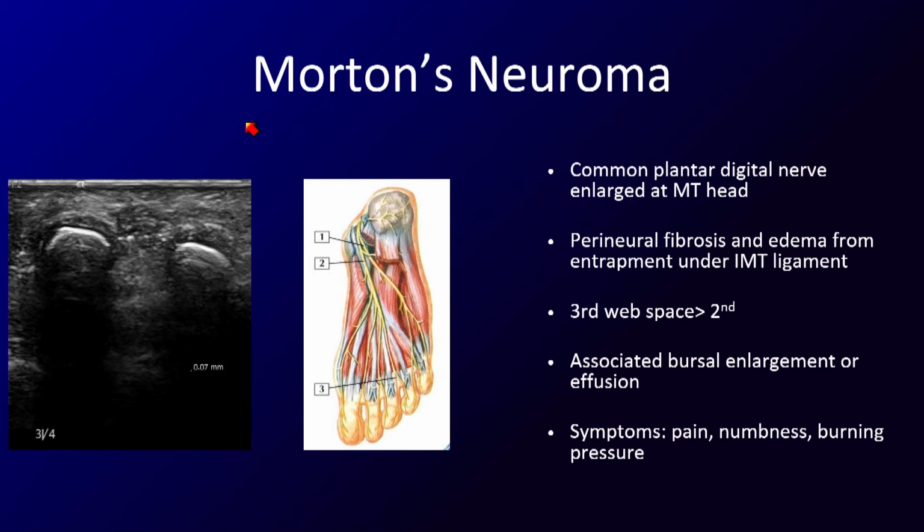Okay, moving on to another form of nerve entrapment, that is the Morton's neuroma. And this was shown earlier. But this is a nerve entrapment that involves a digital nerve, a branch of the plantar nerve.